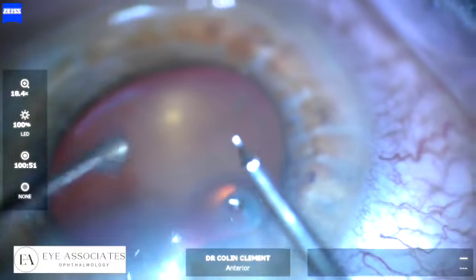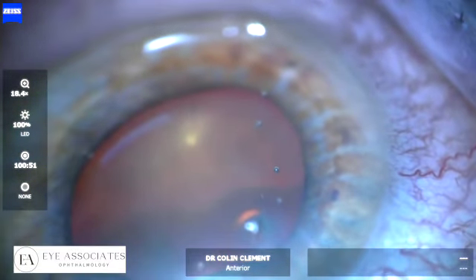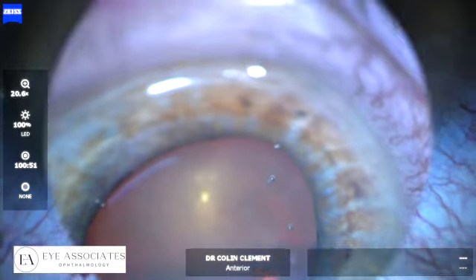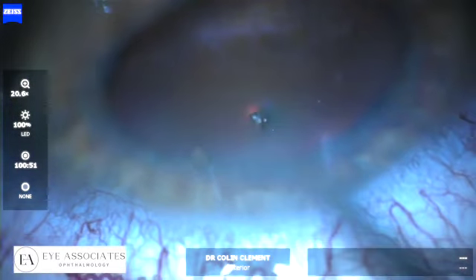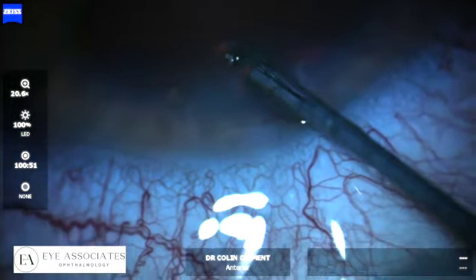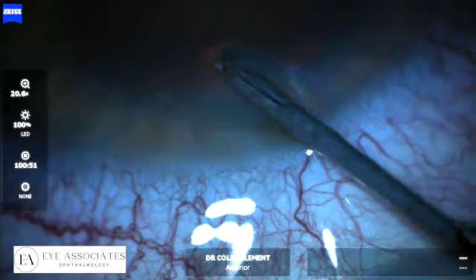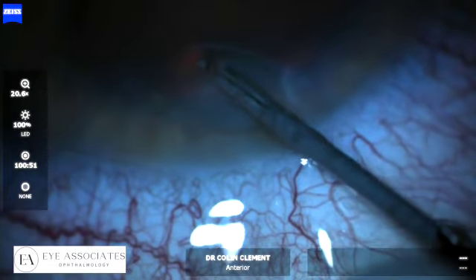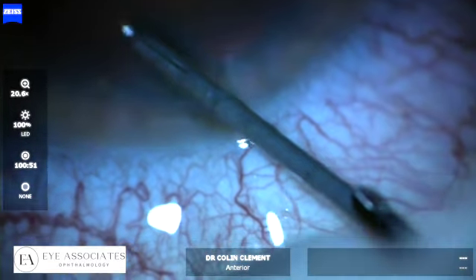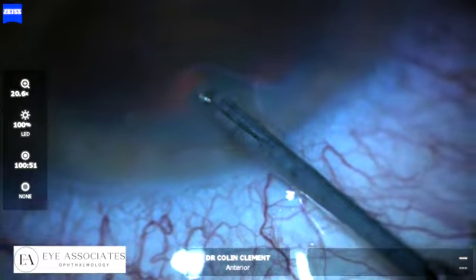It's then positioned with the back of the stent facing the surgeon, and the natural curvature of the cornea is used so that it sits in a flat position, and then the trocar is carefully introduced to the lumen from behind, and the stent re-threaded onto the injector.